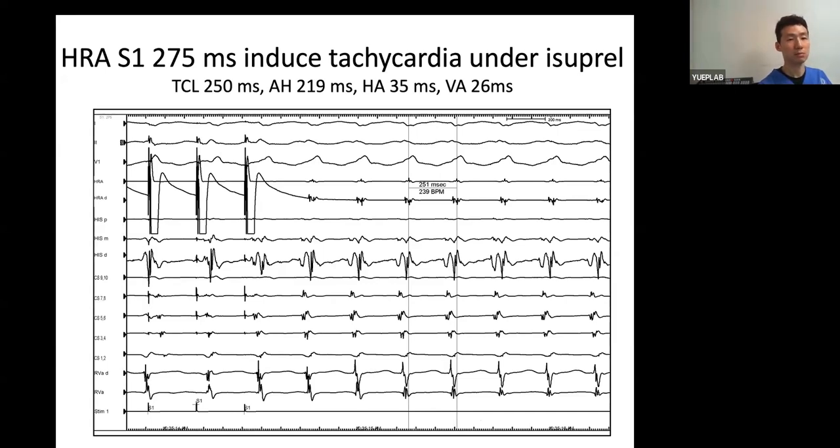Now look at the tachycardia induction. I want you to follow the A. Which one, the sharp one or the small one? What do you think? The sharper one, right? Yeah. And this tracing shows that the CS is clearly earlier, right? Yes. Which is different from what you showed in the jump. That's the argument against your tracing. So this patient has AVNRT, agreed, but the earliest activation is CS 7-8.